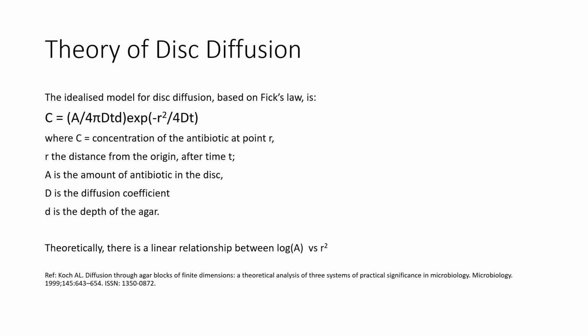If you look at this equation, you will note that there is a theoretical linear relationship between log of the amount on the disc and r squared. And this becomes important, as will be described in the following slide.